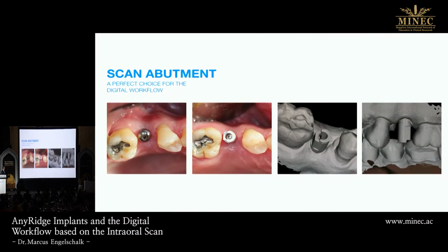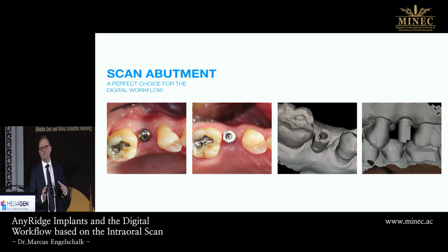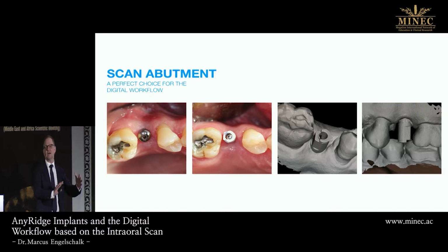And if you change it, this is healed, you change it against the scan abutment, and this is a picture of the intraoral scan. Now you see everything. It's more precise than your impression. Because to be honest, if you have a look on your impression, yeah, it can be good or not. Mostly the technician has to decide if it's good or not.